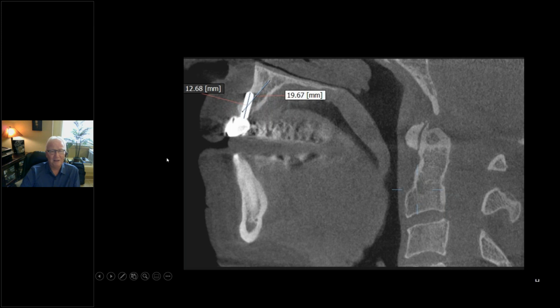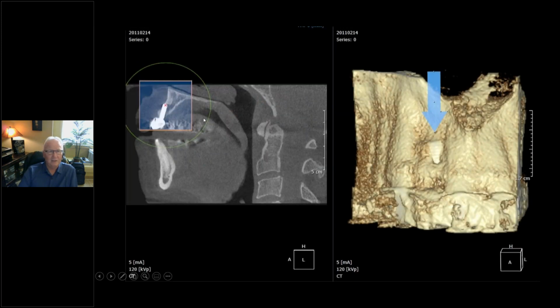I've been there myself. I did a lot of surgery in my dental practice, and there's a learning curve, okay? But if your learning curve is actually eliminated or reduced quite a bit by using good imaging and a surgical guide, why not do it? I mean, look at how much he had. This guy had over 13 millimeters probably of bone, okay? I'm sorry, the implant was 13, almost 13 millimeters. The guy had almost 20 millimeters of length. So if he could have actually hit the middle, he would have had a great implant, would have been there for 20 years. And you can see what happened.